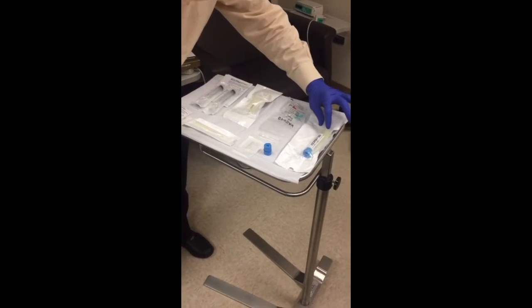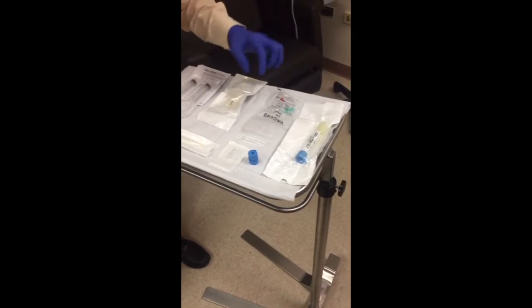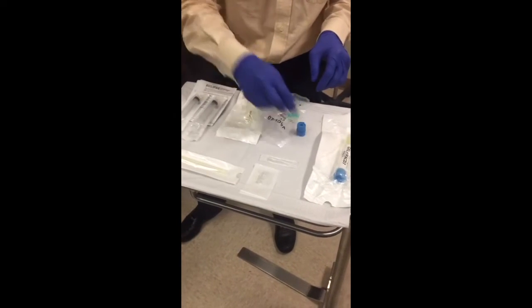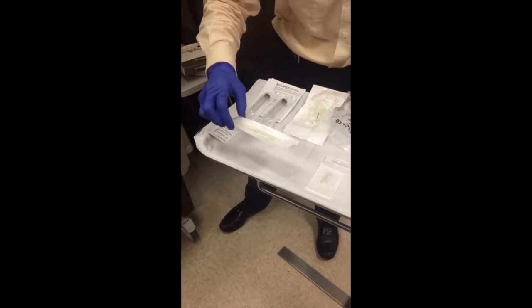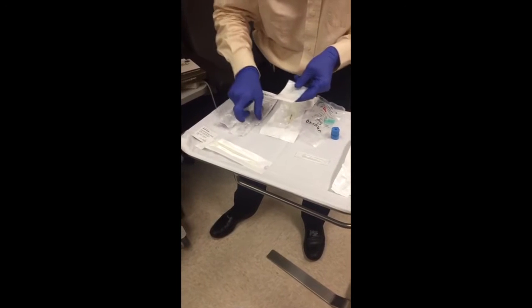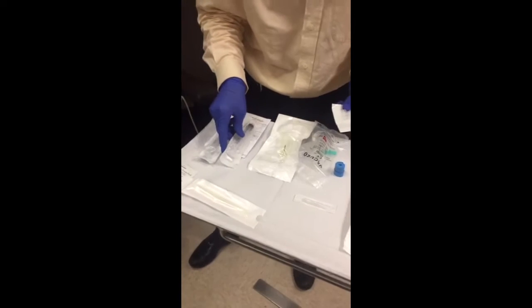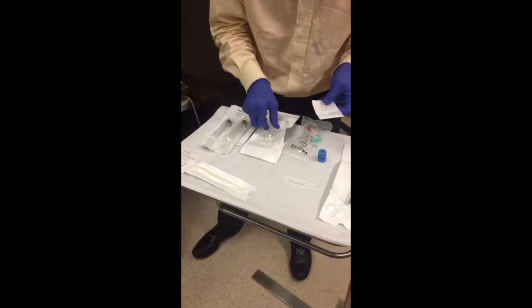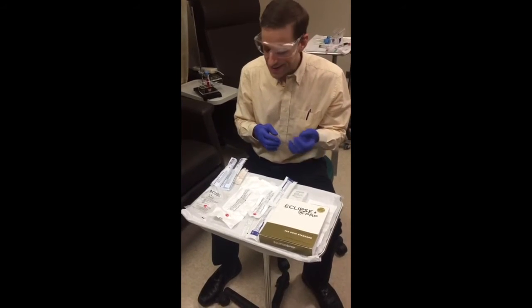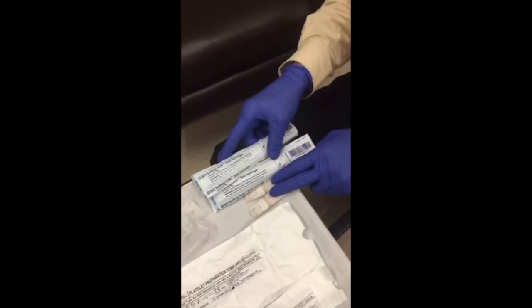We have the gel separator, that's the most important equipment, and then you have a venopuncture setup. This is the needle that you're going to extract the PRP with. This is the adapter that you're going to hook up to the syringe. Not included in the Eclipse package are two 3cc syringes and two 30 gauge needles.